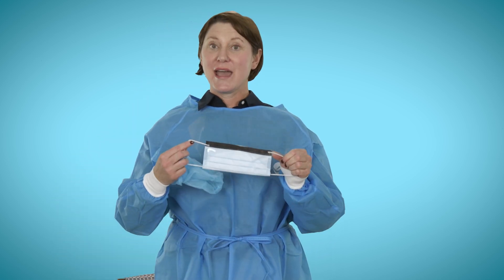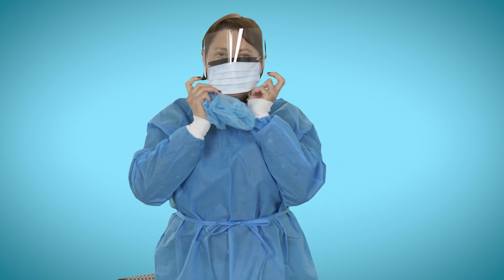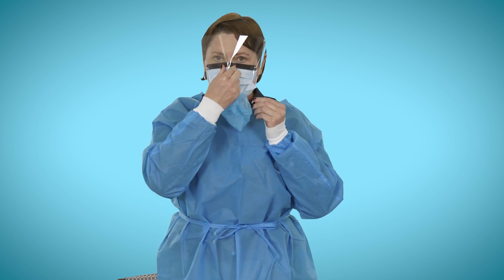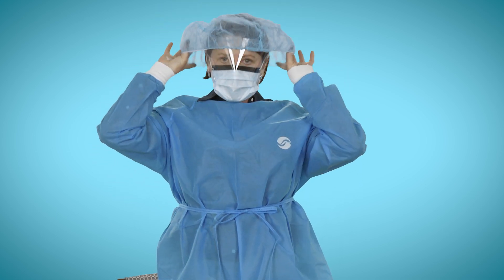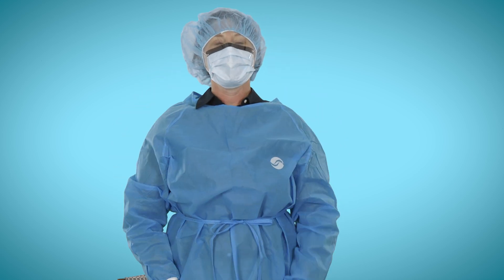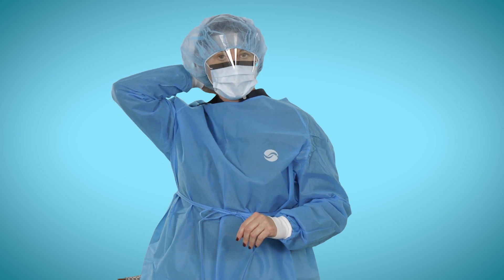Next, you will put on a mask with a face shield. If you do not have a mask with a face shield attached, you can do it separately with a mask and a pair of goggles. This will go on over your ears. Stretch the bottom of the mask underneath the chin and form it to your nose. You will also want to put on a bouffant to cover your hair and the top part of your head. If you have longer hair, secure it with a rubber band and tuck it into the cap and behind the gown.